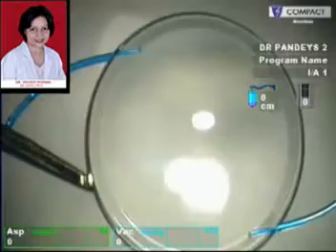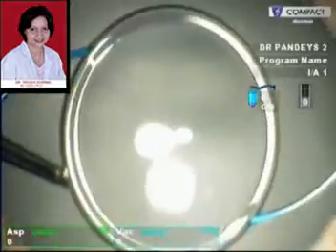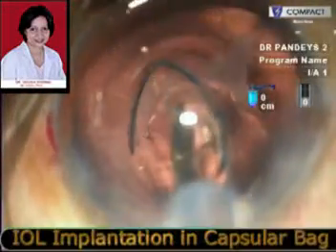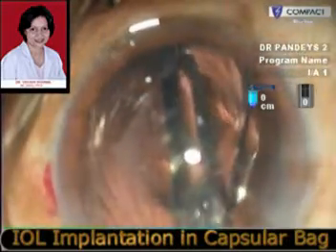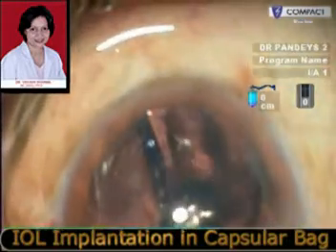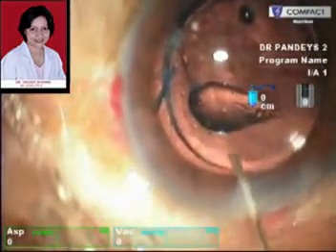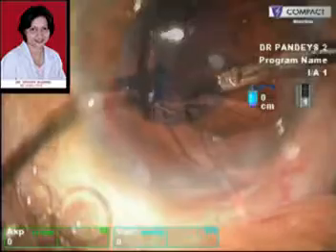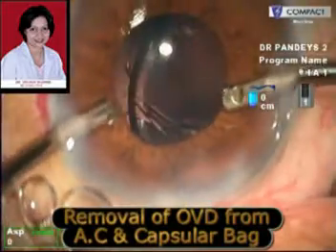Here a three-piece Sensor IOL from Abbott Medical Optics is being injected. This IOL is implanted in the capsular bag. A single-piece IOL may be preferable for some surgeons; however, whatever IOL we use, it should be implanted in a slow, careful manner with slow and controlled unfolding. Of course, needless to say, silicone IOLs are completely avoided and an acrylic IOL is preferable in these cases.